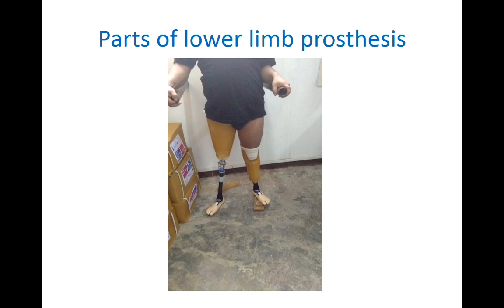Okay, so in this below knee prosthesis, usually the weight is taken in the patellar tendon bearing area. Remember that: the patellar tendon bearing area takes 90% of the weight, whereas 10% is borne by the medial aspect of the stump. I think you're clear with that.